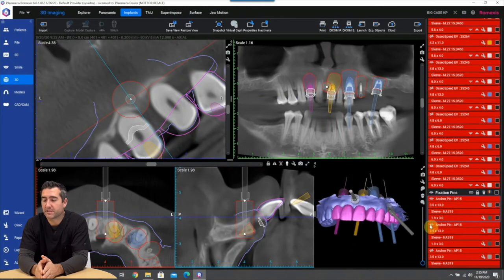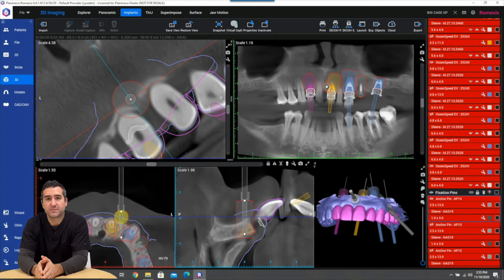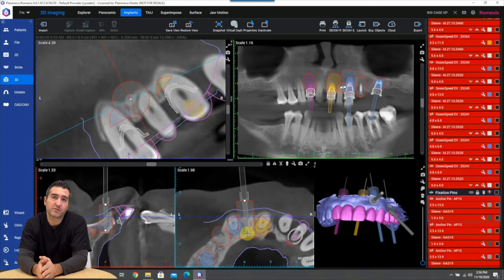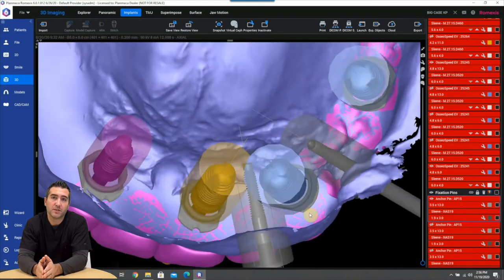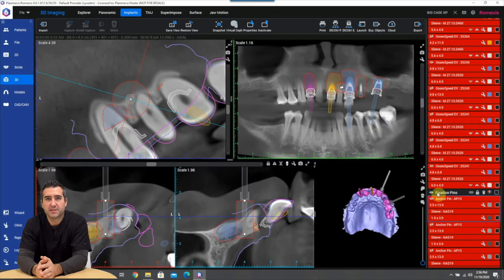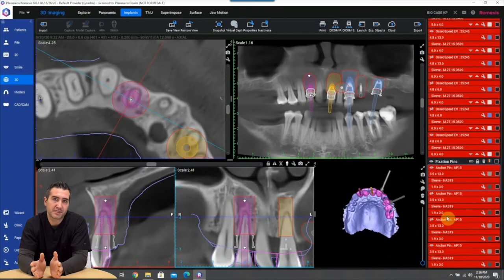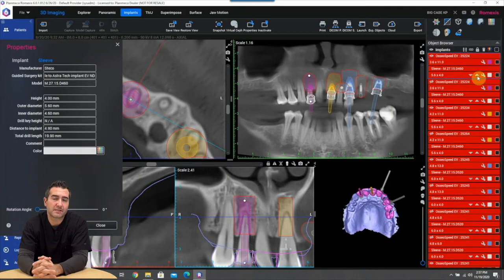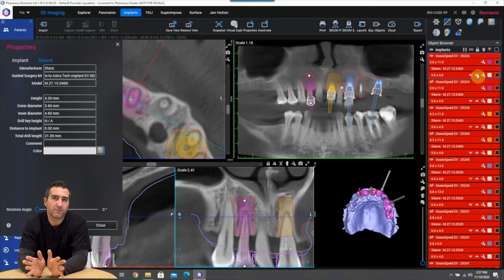If it's not platform switch you better not place it deep in the bone, you're going to get die back. So you want to place that just a little bit supercrestal. So all these things matter and you need to know what implant you're placing to determine the depth. It's not just like a mindless thing that you just automatically for every implant you put in the same depth.